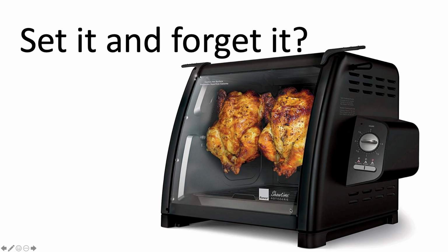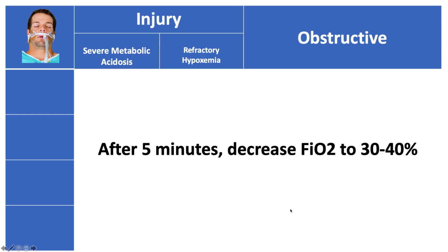So this isn't the Ronco roaster. We can't just set it and forget it. We have to stand by that machine and start adjusting dials and adjusting different settings to make sure we have the right pathway. Now, initially said set the FiO2 at 100%. Now, we can't leave patients on that. Again, that's where you get long-term lung damage. So after about 5 minutes, it's best to go ahead and decrease this down to 30 or 40%. Don't just slowly titrate it down. Go ahead and decrease it pretty rapidly and then see what the patient is doing.